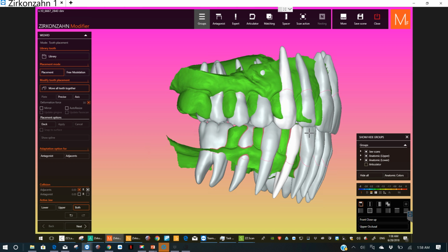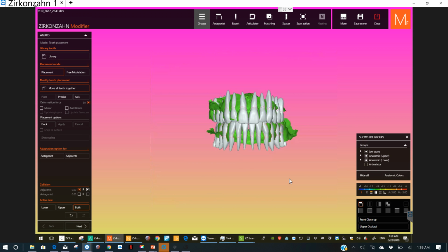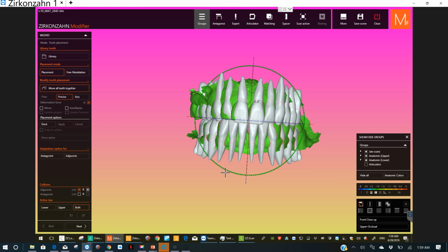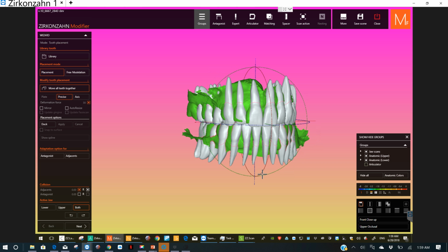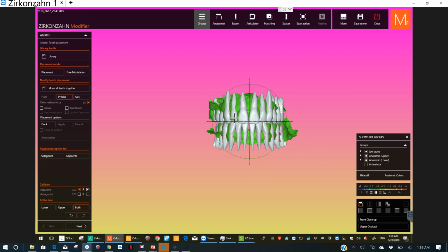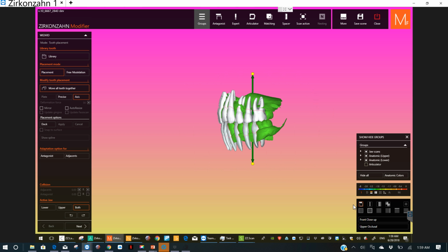Okay, and I'm going to go into a couple other things just to show what we can do. So we have precise mode, which if you had to do a little rotation of the teeth, you could. You can do that in any way. And if you don't like something you do, just go back right there. So that's precise mode, but I'm kind of liking where this is right now. And axis mode is kind of an important one. That's where you can change the axis of the teeth.